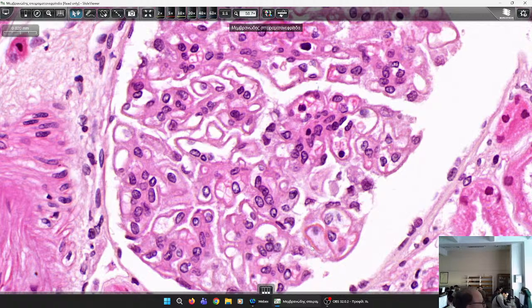So, how can you tell that this is membranous glomerulopathy? You perform a silver stain which will stain the basement membrane and all collagen 4 containing structures black. And as the immune complexes press the basement membrane, the glomerular basement membrane will appear as spikes. And this is consistent with the established membranous glomerulopathy.